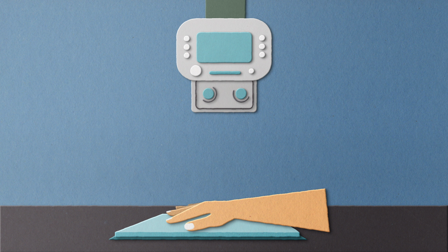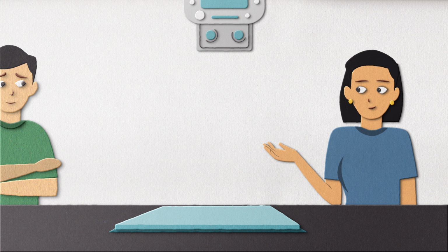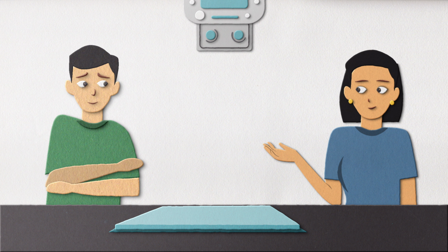The test works by firing X-rays at a part of your body and using a film called an X-ray detector to capture the X-rays that pass through your tissues. The denser areas absorb more of the X-rays and appear lighter, white or light gray on the image. X-ray tests are widely available and commonly used as a diagnostic technique, particularly for orthopedic issues.